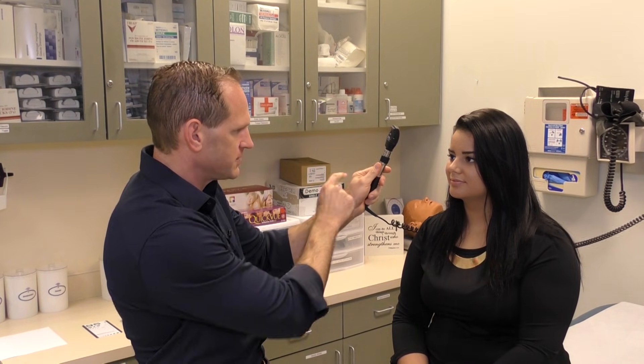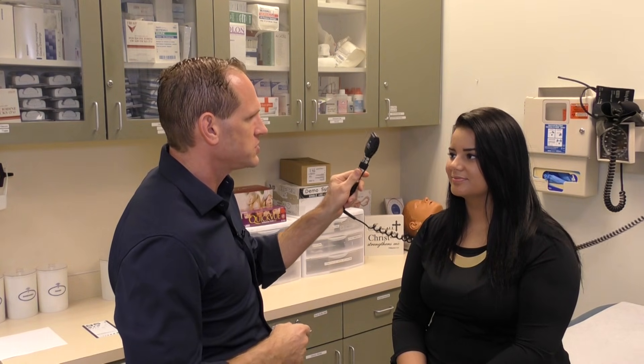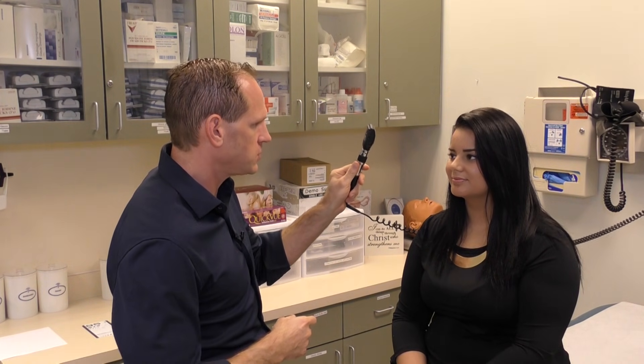Notice the technique — watch how much movement there is in the hand. New practitioners tend to startle the patient; you don't need a lot of movement, just a small shift. You're looking for direct constriction, then consensual, then direct, then consensual on the other side.